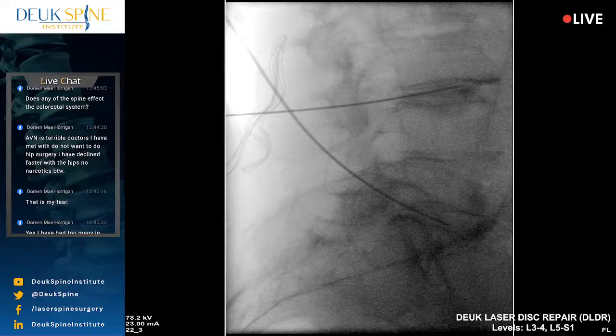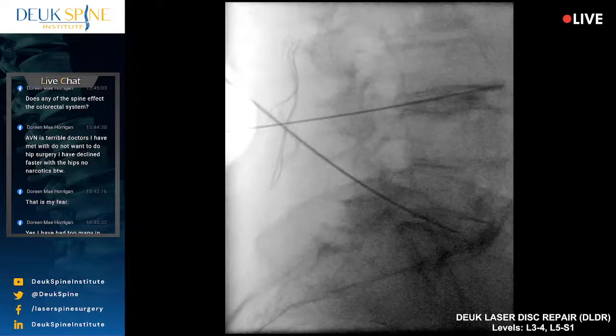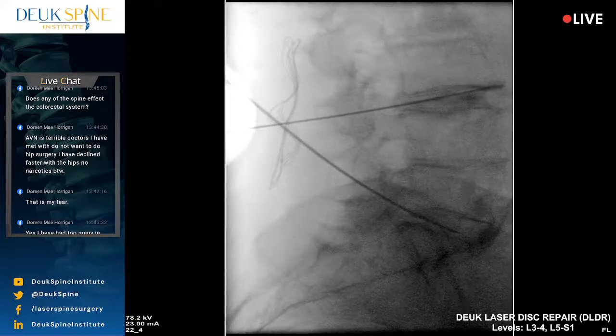All right. I have to get this stylus out because it is literally stuck inside. Can you put pressure here? It's not stuck in the patient. It's supposed to slide out of the needle, and that's not happening. I'm going to have to come here. Fascinating. All right, well, I may have to replace that needle.